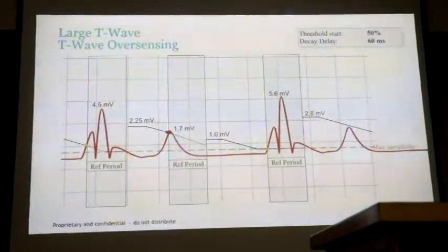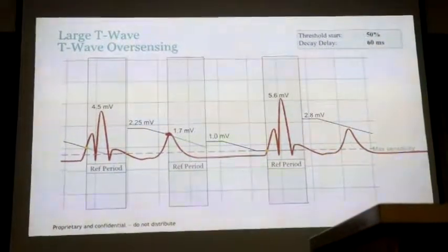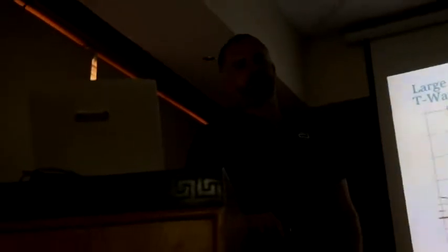If I'm to change one value at the beginning, which would be safer? Delaying the decay delay? Again, you have to send it. Yeah, we really want to see it. I wouldn't make a guess on it. Do you redo the VF test with the induction after changing such parameters? That is a consideration, but we leave that to physician decision.